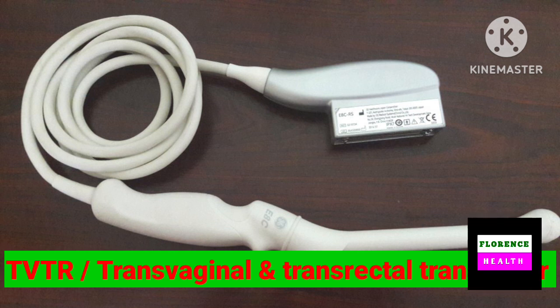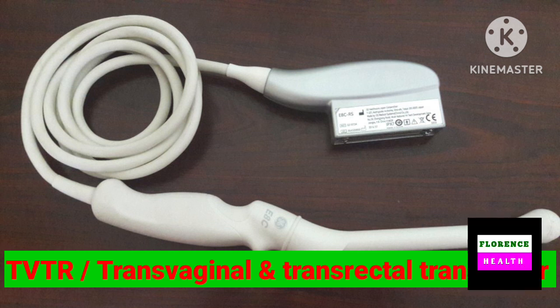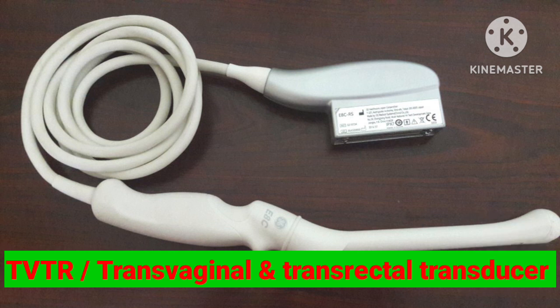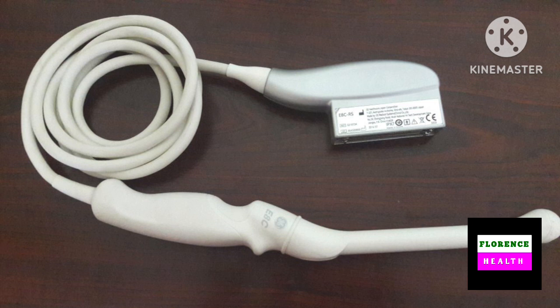As I have already told, frequency and penetration are inversely proportional. When frequency increases, penetration decreases. That's why the probe using higher frequency has low penetration and vice versa.